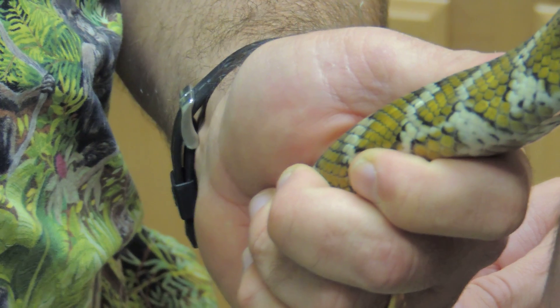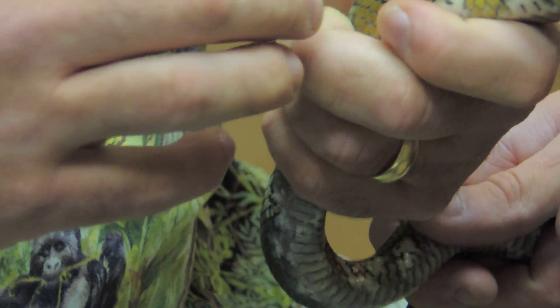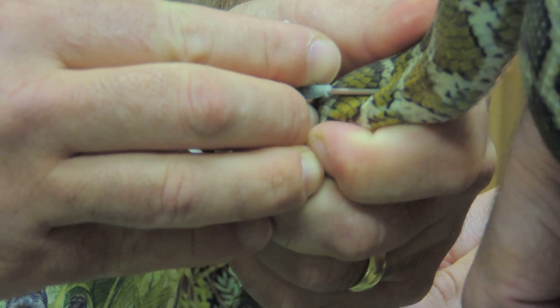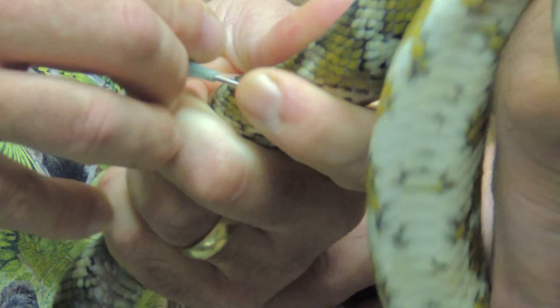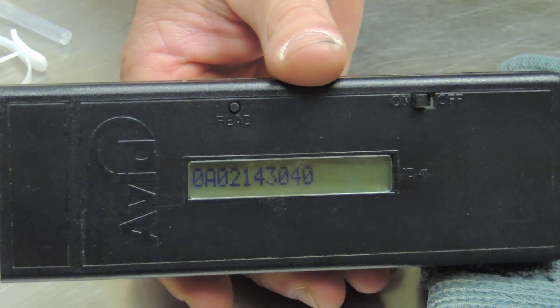So we'll go ahead and put this in. There is our new number, or our only number. And that should do the trick.